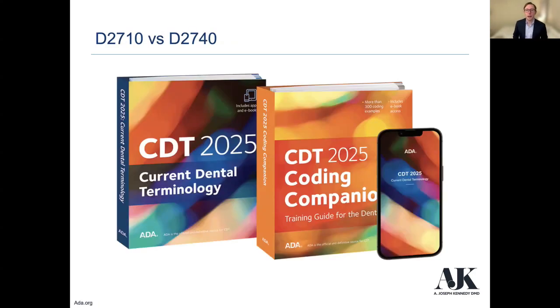Now, I called the ADA on this because as an ADA member, you do have resources and someone who works in a department that will talk to you about these CDT codes and get you the information. And I just asked, hey, I'm a dentist and I'm printing resin-based crowns that have a filler content of 50% or more, ceramic-impregnated or ceramic-filled resin crowns. What code can I use? Am I interpreting this the right way? What are other dentists that are calling in using? And I was shocked to hear that many are using the 2740.